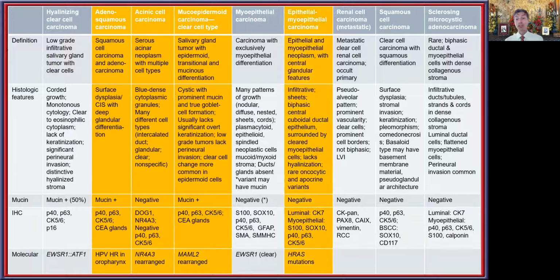However, often they are just two separate tumor categories where you can see well-developed squamous differentiation and well-developed glandular differentiation just juxtaposed next to each other, or in essence, maybe even considered collision in some instances where they seem to be two separate components. Very frequently, surface origin will be identified, and of course, mucin production can be seen in these tumors as well. They are much more biologically aggressive than squamous cell carcinoma and usually have a much more advanced stage, although at this particular point, as it relates to the HPV, there is still a better overall outcome for patients who have oropharyngeal primaries.